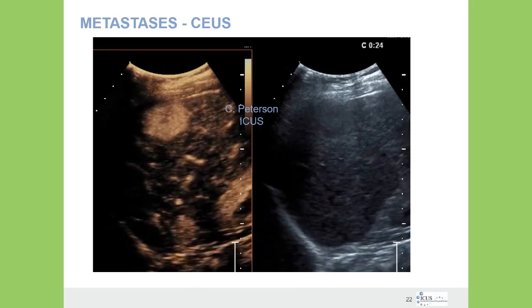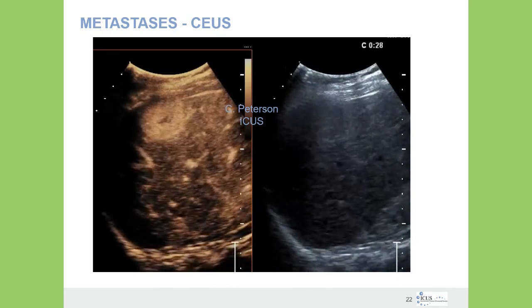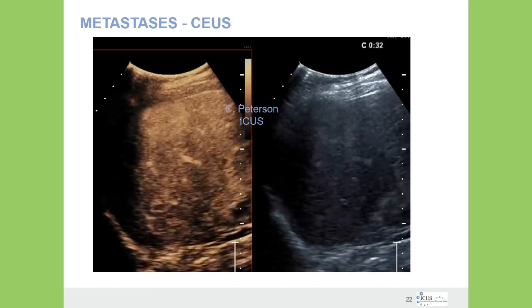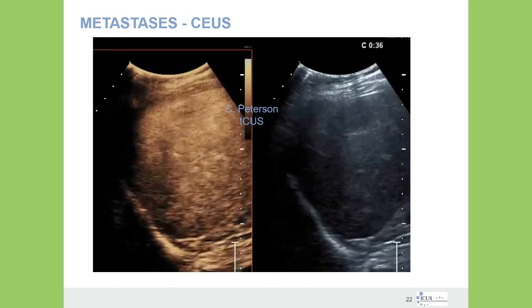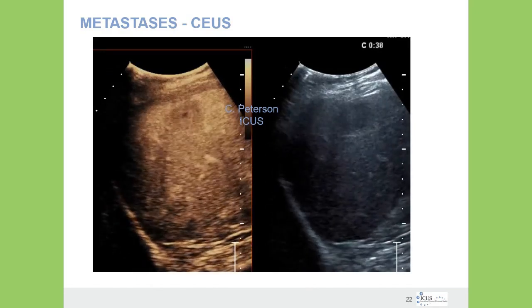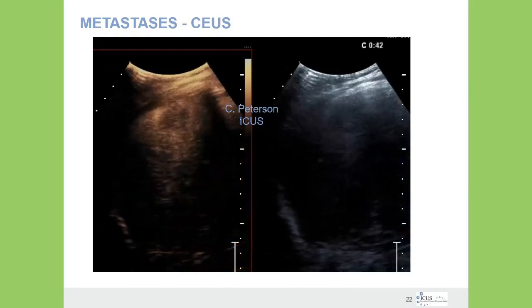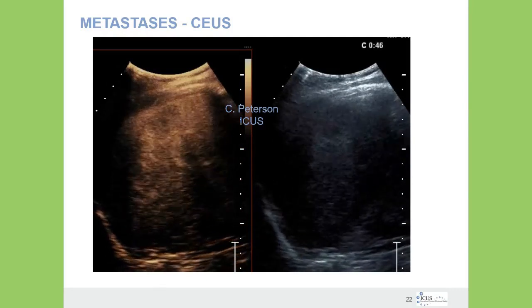You can see the lesion enhancing in the near field, as well as an additional lesion further from the transducer, and there's one a little more superiorly that comes in and out as the patient breathes. This patient is breathing shallowly, no held respiration in this case, and we saw that lesion enhance, but notice now that the lesion has less contrast than surrounding tissue.